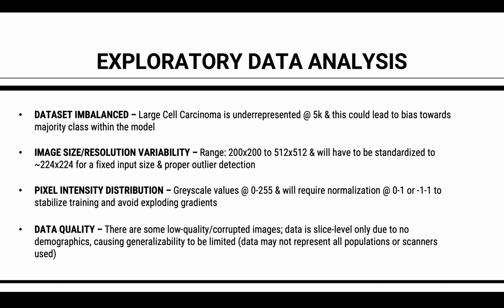Second, the image size and resolution vary significantly, from 200 by 200 pixels up to 512 by 512 pixels. To manage this, the images will be standardized to approximately 224 by 224 pixels for consistent model input.